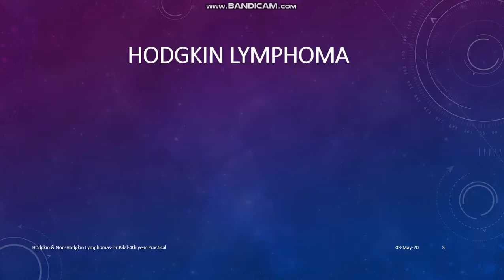And now we move on to Hodgkin lymphomas. Now remember, Hodgkin lymphomas are generally divided into two: classical Hodgkin and nodular lymphocyte predominant Hodgkin lymphoma. The classical variety is further subdivided into four. So we'll see a few of them one by one. What are the basic differences with respect to morphology?